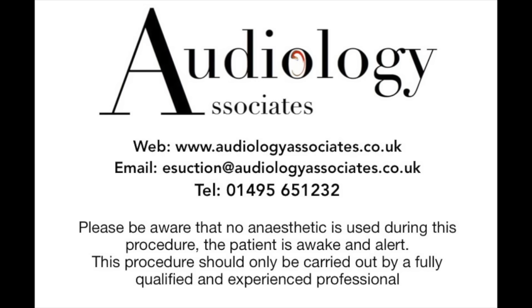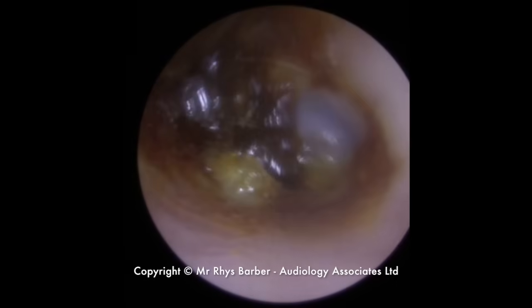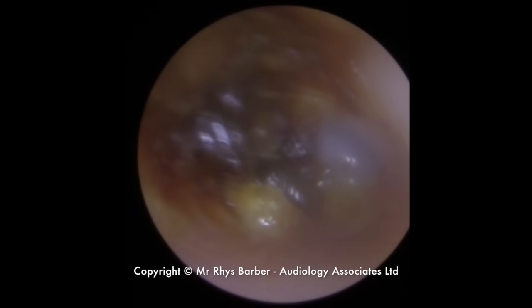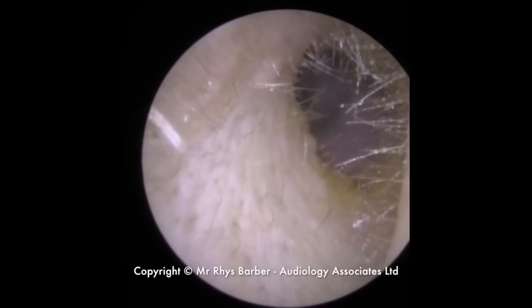Hi everybody, this is Rhys Barber from Audiology Associates and we've got another earwax extraction video for you today. As you can see, we have some very deep-seated earwax which is stuck almost on the eardrum itself. So quite a difficult one to do.